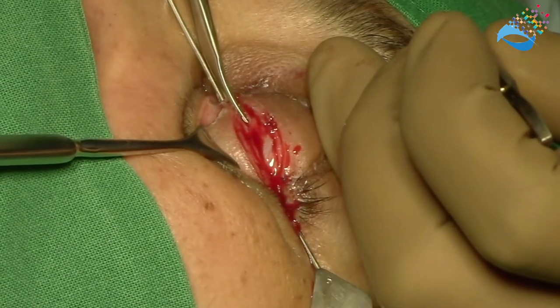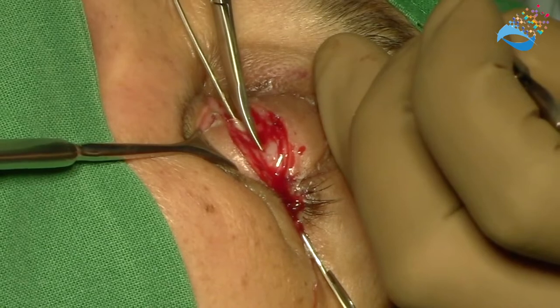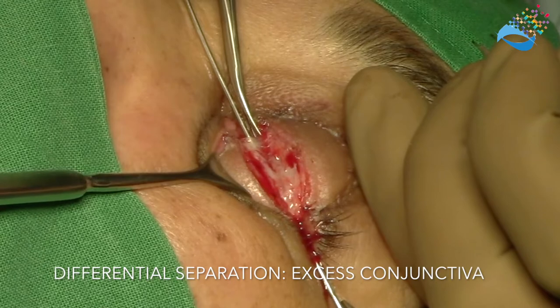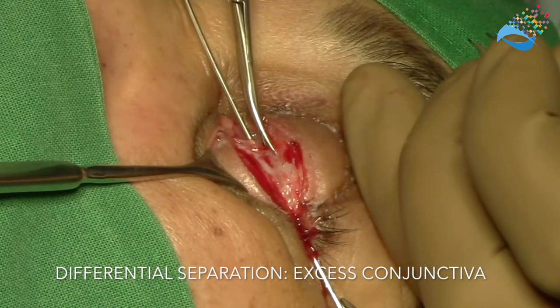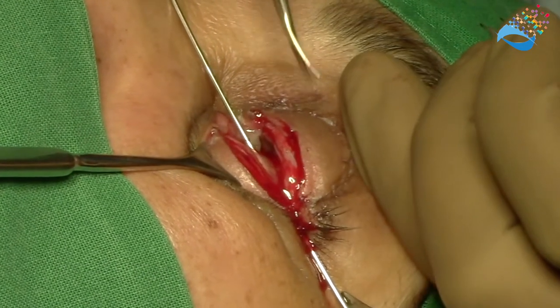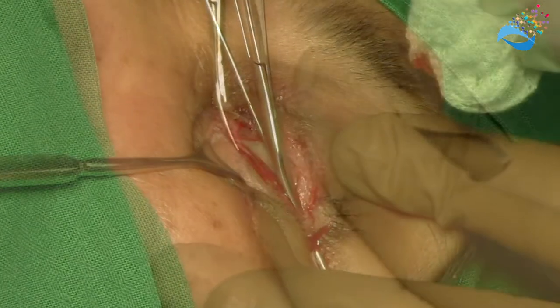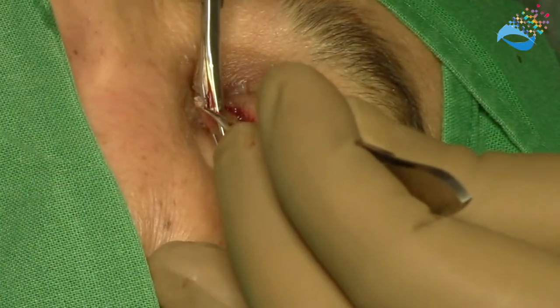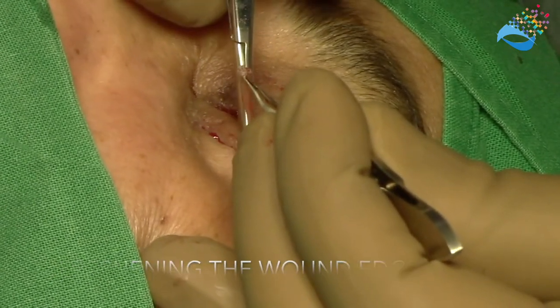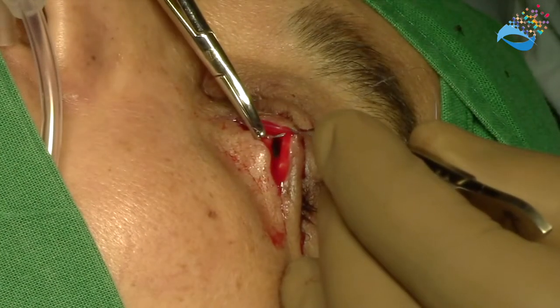The eyelid is separated differentially such that excess conjunctiva is incorporated into the upper eyelid. This conjunctiva at the edge of the wound would later on be turned upward to reform the upper eyelid margin. Formation of the lower eyelid involves freshening of the wound edges such that on suturing the wound heals completely.